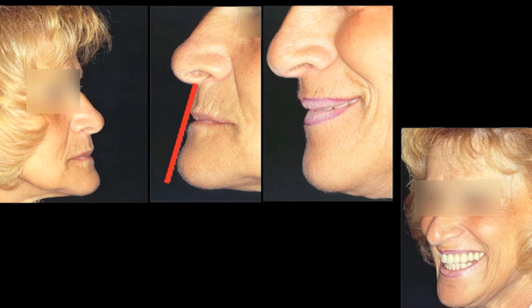And if we look at the red line on the facial, it completely demonstrates how she looked with her old dentures. And now if we drew the same line, we have pretty much a vertical appearance, and it gives her the facial aesthetics that she so wanted and so desired.